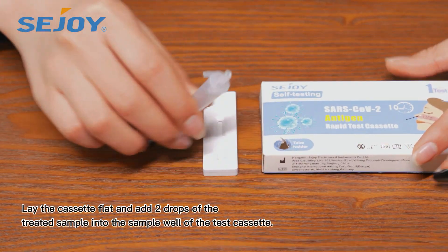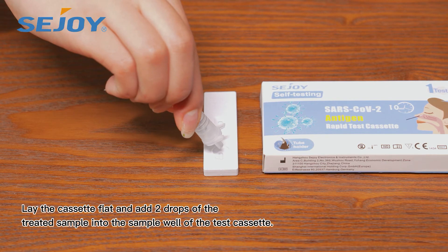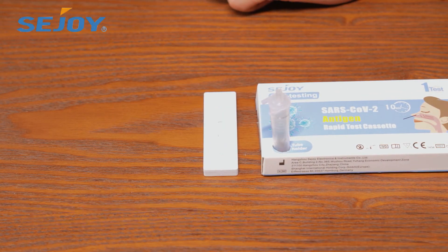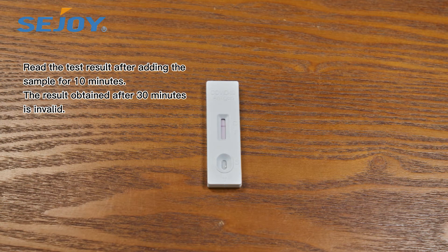Lay the cassette flat and add two drops of the treated sample into the sample well. Read the test result after adding the sample for 10 minutes. The result obtained after 30 minutes is invalid.